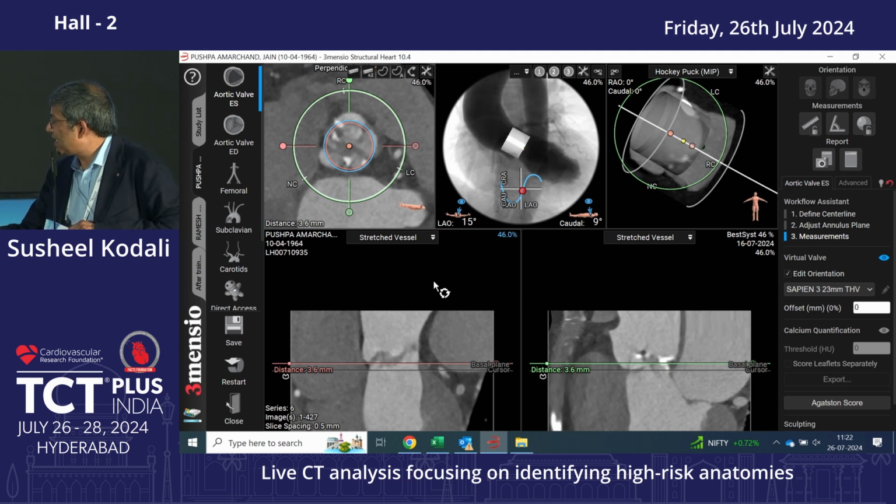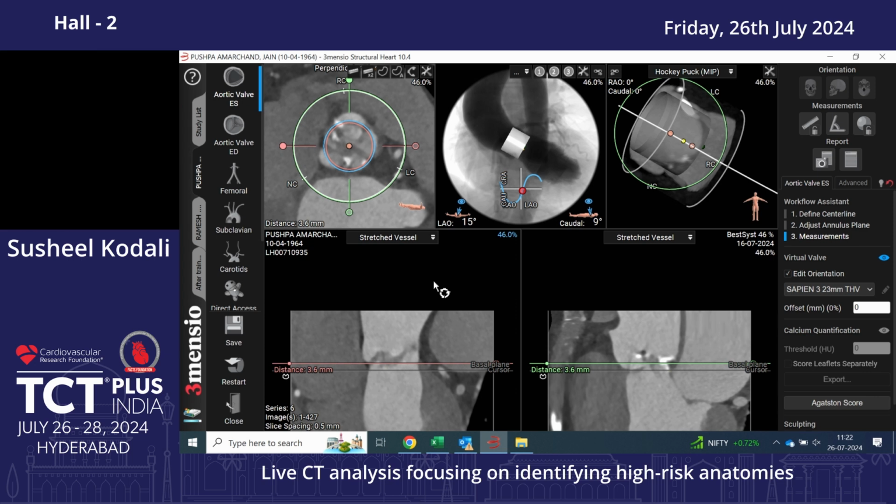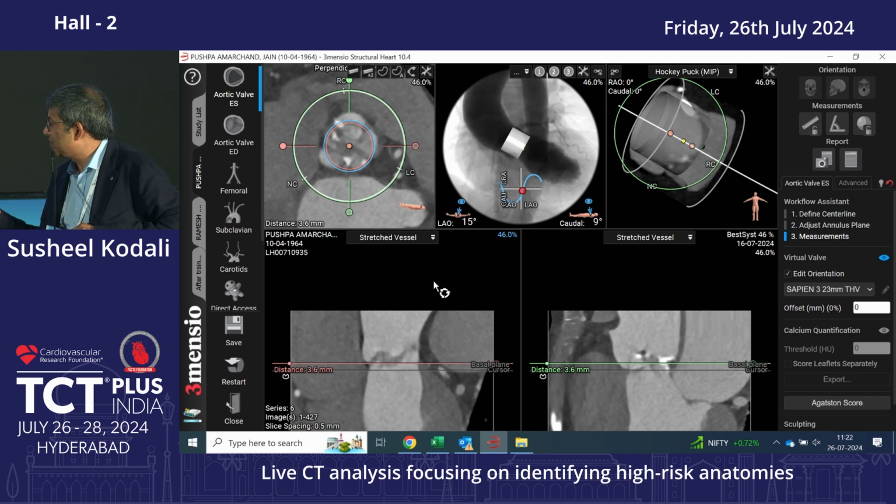The idea with DASI or FEops or whichever company is going to be the same. You get your TAVR scan. If it's in the US, for example, it's a reimbursed analysis. It will be sent out, and you'll get back the risk of root injury with a 26 Evolut versus a 29 Evolut versus a 26 Sapien. What is the risk of PVL? And you can have a more honest conversation, because that's where AI and all these things are getting us.